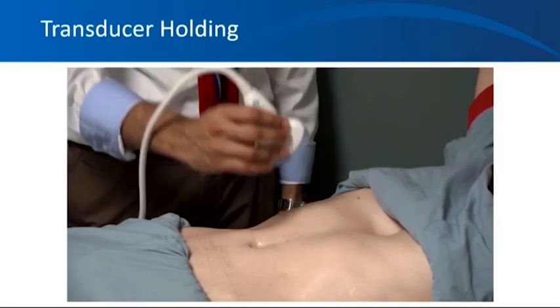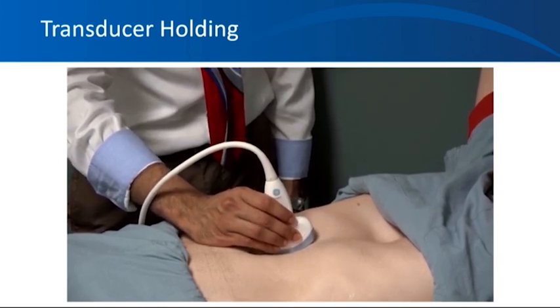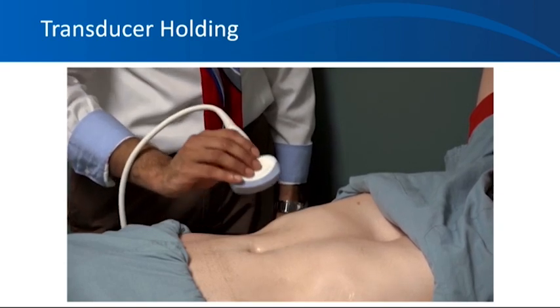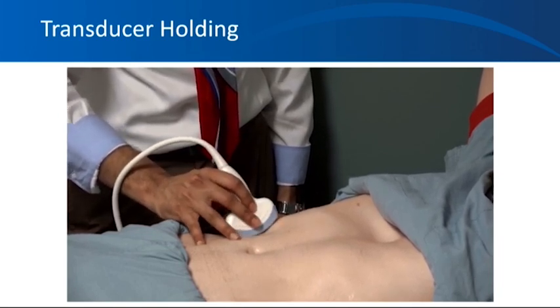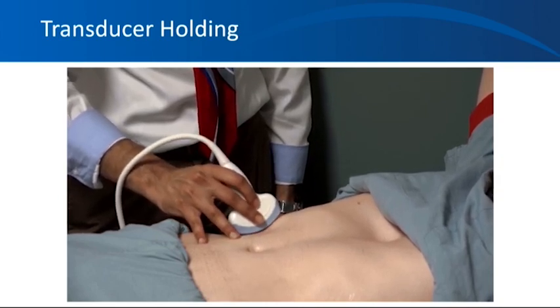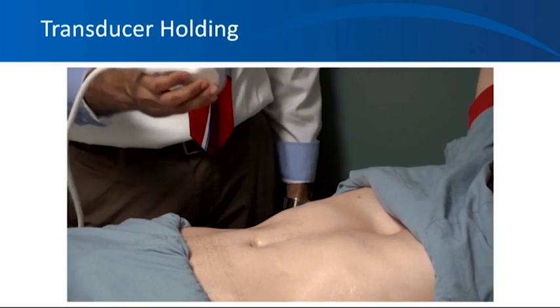Probe holding. How to hold the probe in the right way? Grasp the probe with the first three fingers of your dominant hand. And depending on what part of the body you're scanning, you can use your ring and little finger or the heel of your hand to stabilize the probe on the patient's body so that it doesn't slide down, especially when you're using a lot of gel. That way, you don't have to apply too much pressure on the patient's body while stabilizing the probe when you're reaching out to the machine to switch modes or measure something.